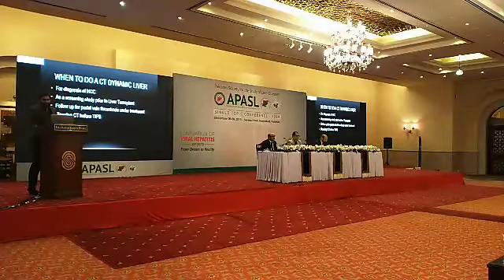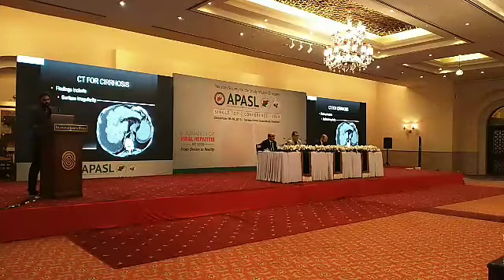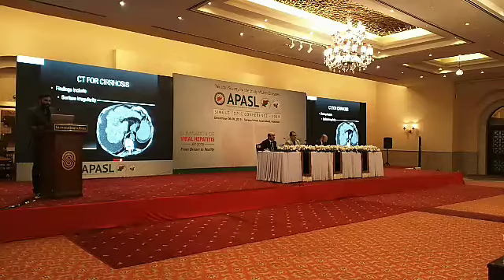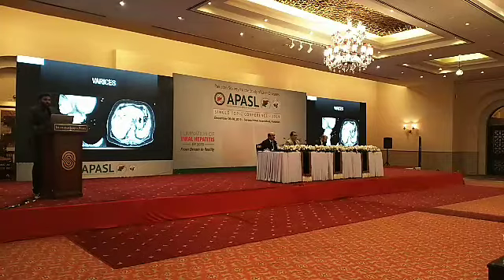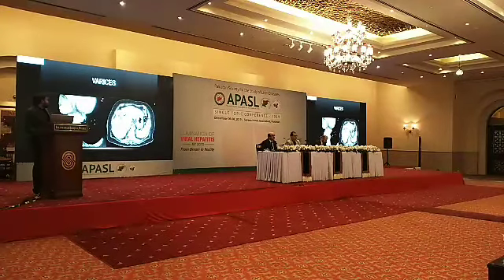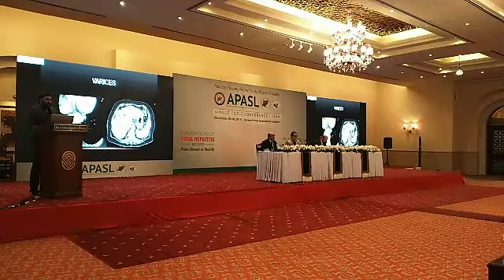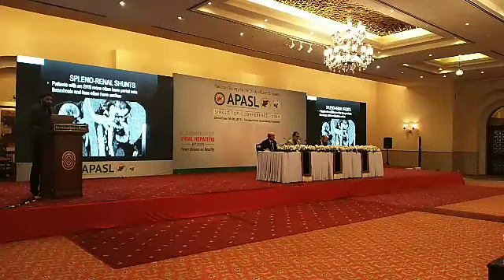There are other indications as well. But I'll show you a few images of CT in cirrhosis. There is obviously a surface irregularity and nodularity, and that is visible in the shrunken liver. Varices are important findings in cirrhosis. These are massive paraesophageal varices, and the image on the right shows the patent umbilical vein. Now varices are detectable under ultrasound, especially the patent umbilical vein, and that should be looked for.